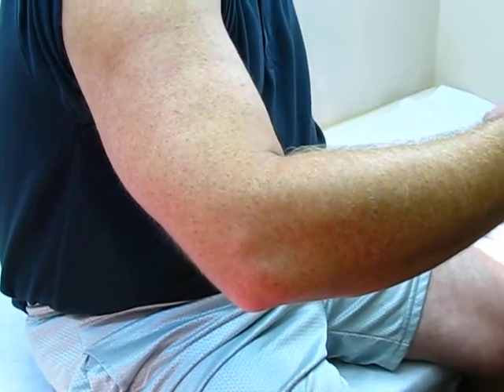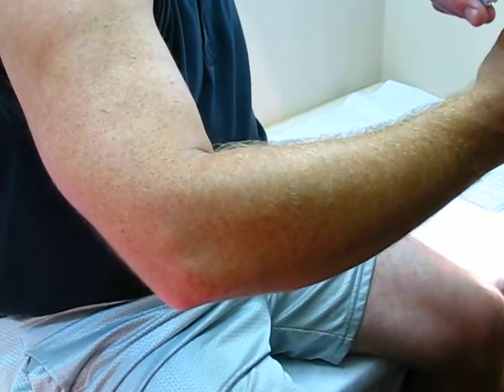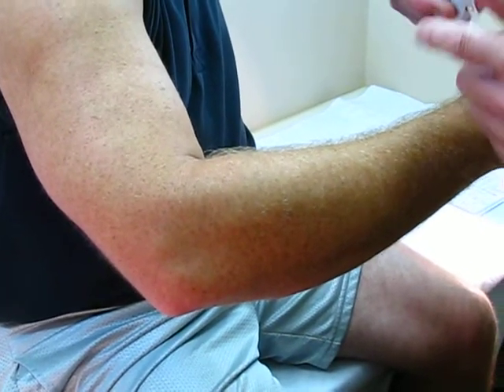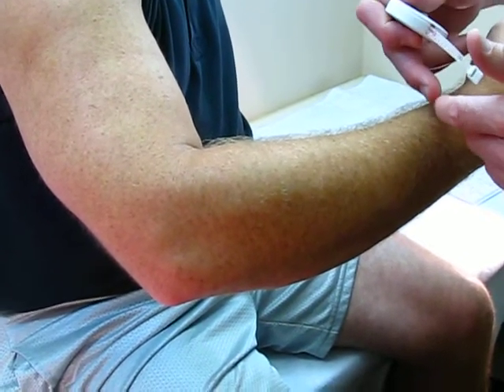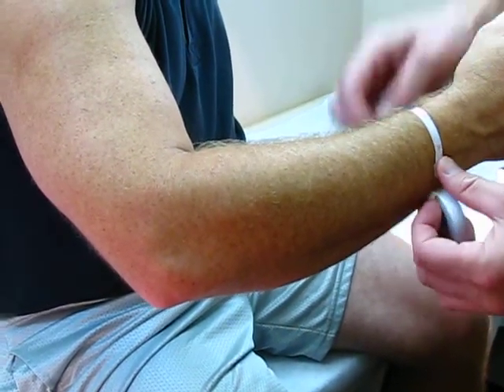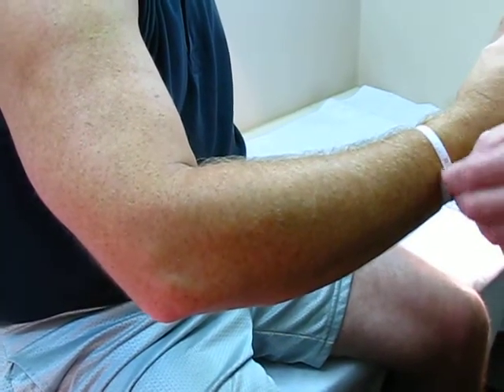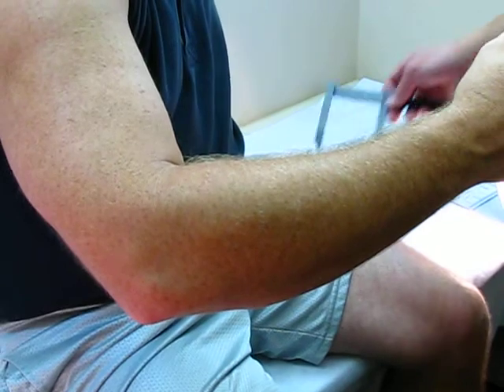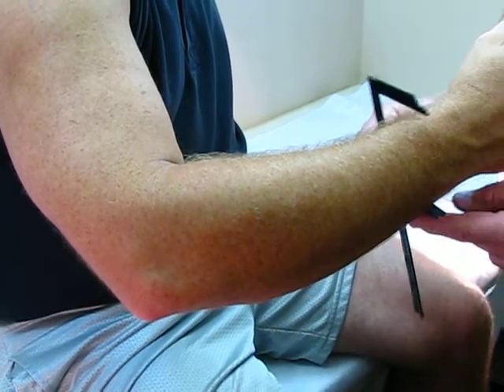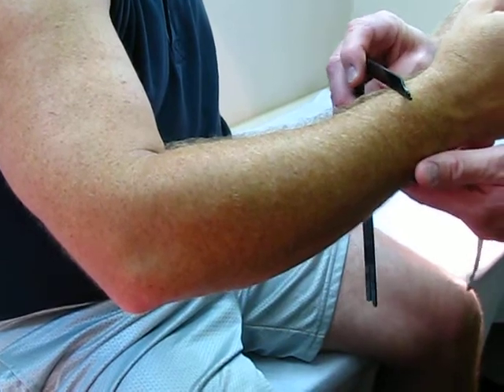Measurement C is going to be a circumference on the forearm at the level where you want the frame to end. We'll take that circumference, and at that same level, we will do a medial lateral measurement as well.